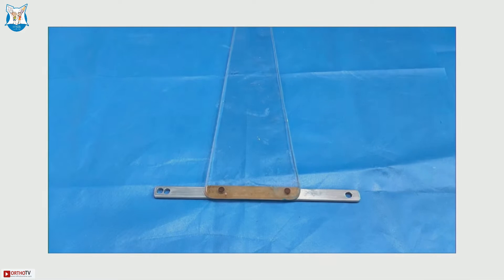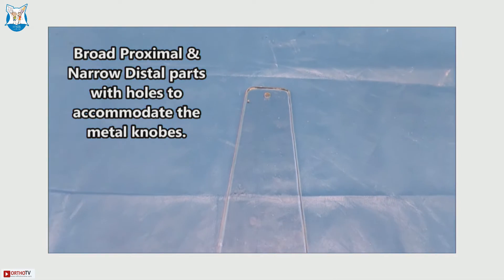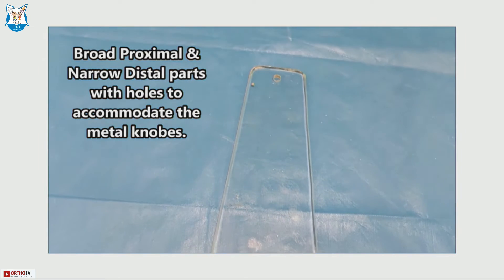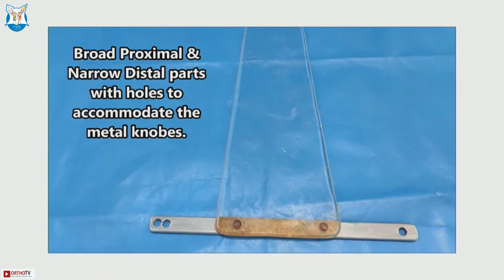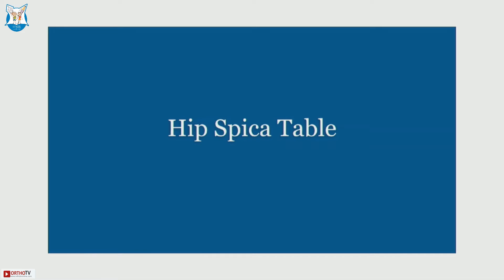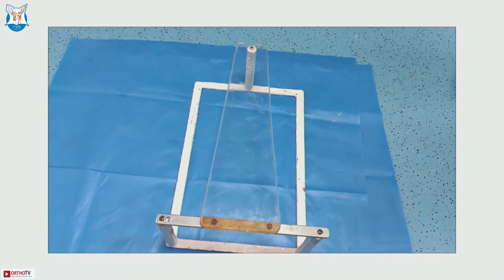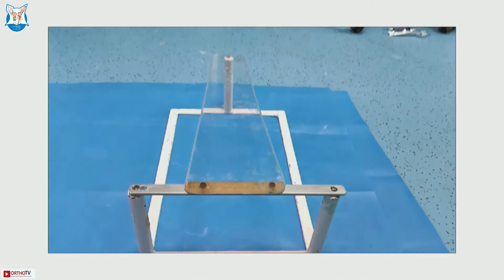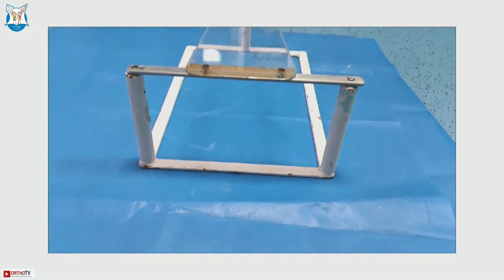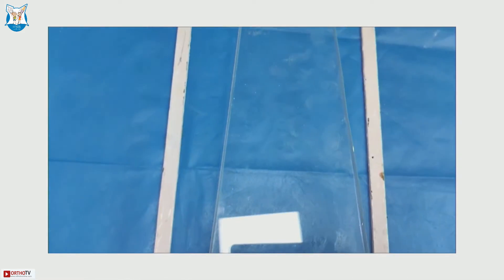The acrylic sheet is trapezoid-shaped with a broad proximal and narrow distal part, with holes to accommodate the metal knobs so that it can be very securely fixed on the metal board. The acrylic sheet should be mounted on the metal part like this. The total weight is 1.7 kilograms, the length is 1.25 feet, and the width is 1 foot.